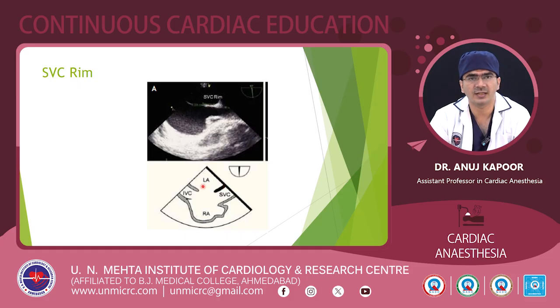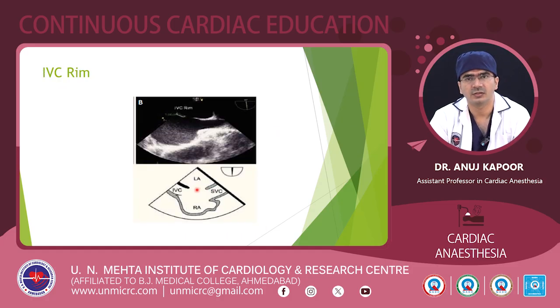Here also we can visualize the ASD well, and the flap, which we will discuss further. The IVC rim is also visualized in the same view. It is fundamental to obtain this rim and get the length of it, because device closure would be challenging in its absence. It is, however, usually the most difficult to measure, and retroflexion of the probe can help us get the exact size of the IVC rim.